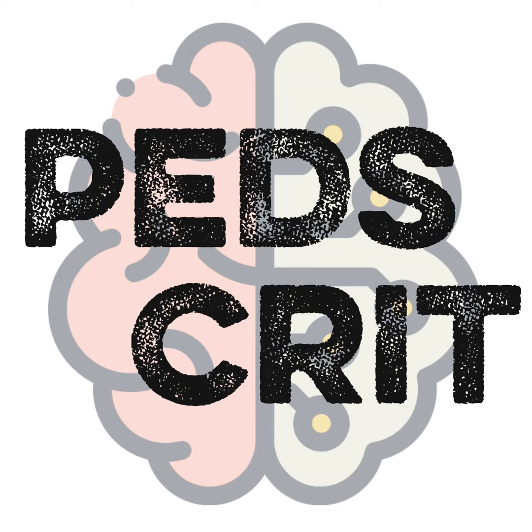The 2 VVs that are in our database were because of status asthmaticus and massive barotrauma, because they came in with massive barotrauma from another hospital already. Those were the ones we managed with VV. Yeah. So if refractory hypoxemia and recruitment doesn't work, flip prone, and if then no improvement in several hours, then probably cannulate. And a follow-up question here: what level of FiO2 do you determine we've got appropriate recruitment?